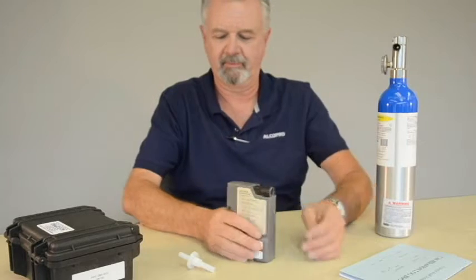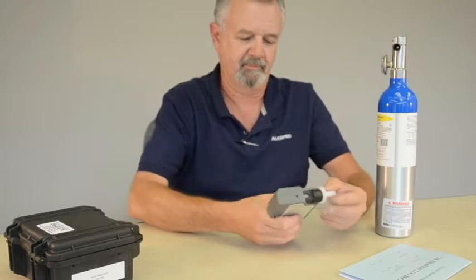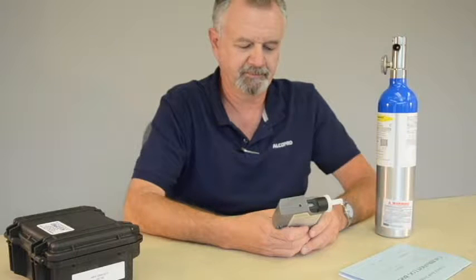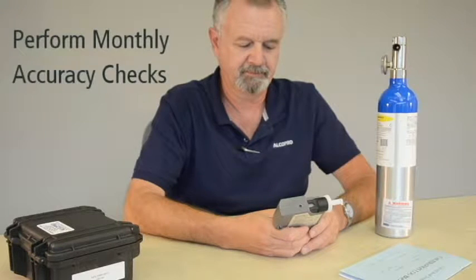An accuracy check is a test of your instrument's ability to read a known alcohol standard within a given tolerance level. A best practice is to perform accuracy checks once a month to document that your instrument is continuing to give accurate results.